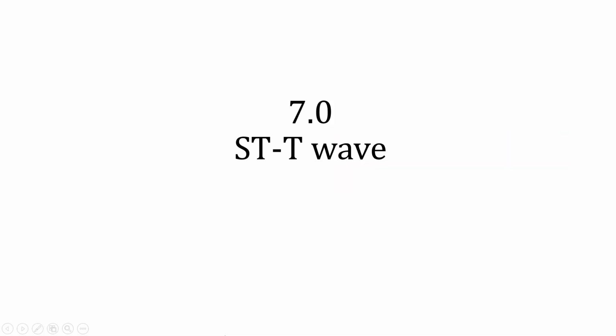Next up is 7.0, ST segment and T wave abnormalities, as well as other indicators of ischemia and infarction.